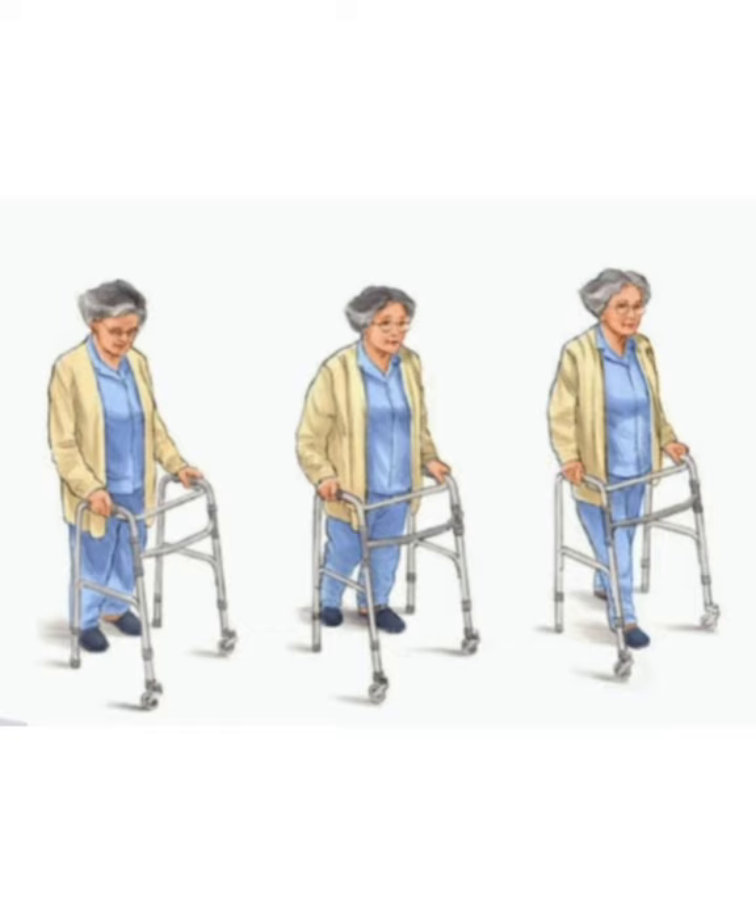Be aware of obstacles such as electrical cords, rugs, and uneven surfaces whenever walking with an assistive device.